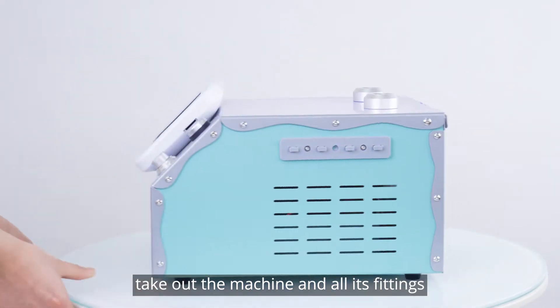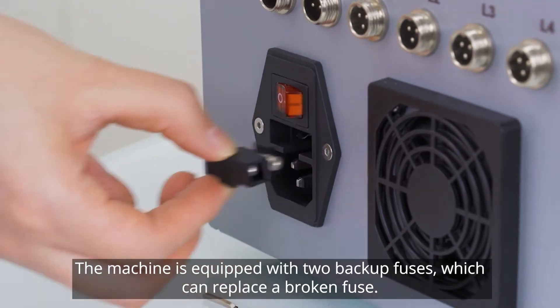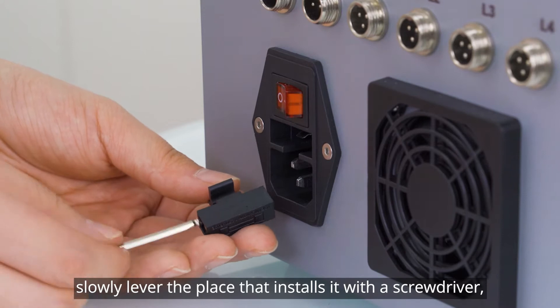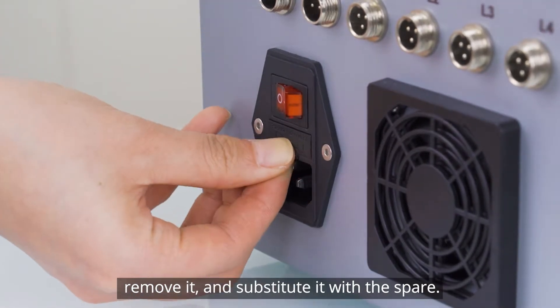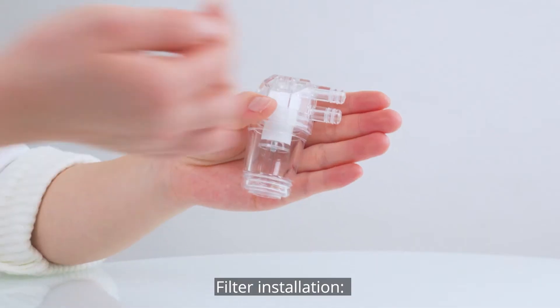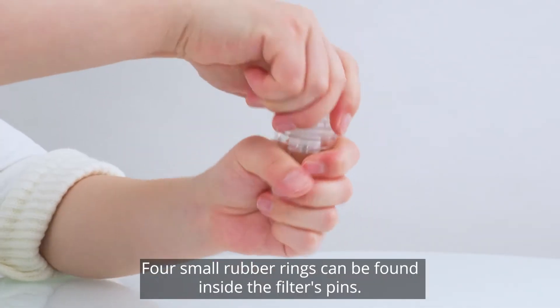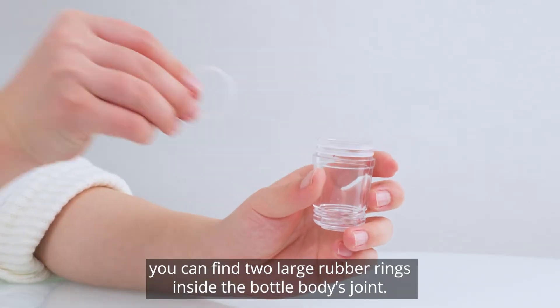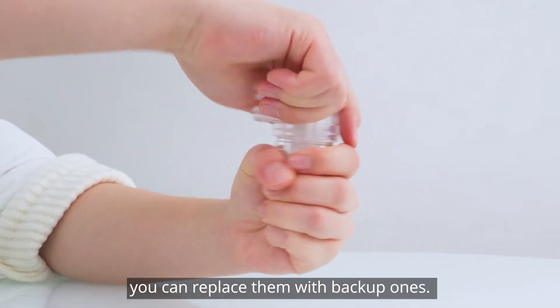Take out the machine and all its fittings. The machine is equipped with two backup fuses which can replace a broken fuse. If the fuse is damaged, slowly lever the place that installs it with a screwdriver, remove it, and substitute it with the spare. Filter installation: small rubber rings can be found inside the filter's pins. If you unscrew the filter, you can find two large rubber rings inside the bottle body's joint. If they are damaged, you can replace them with backup ones.